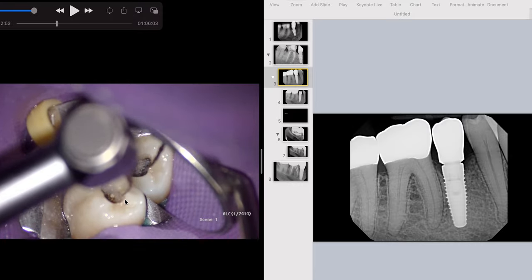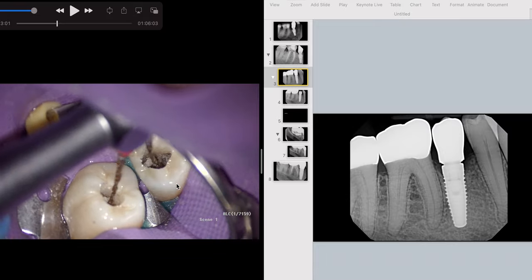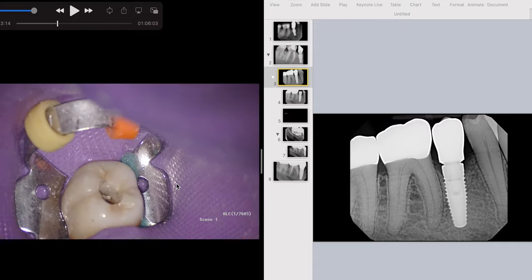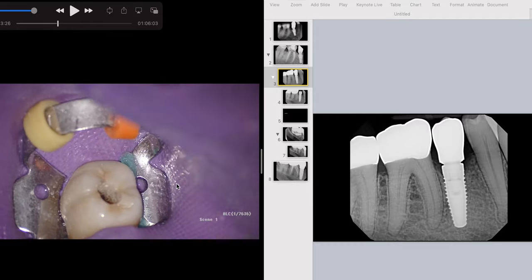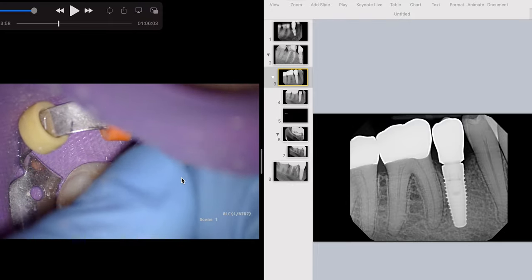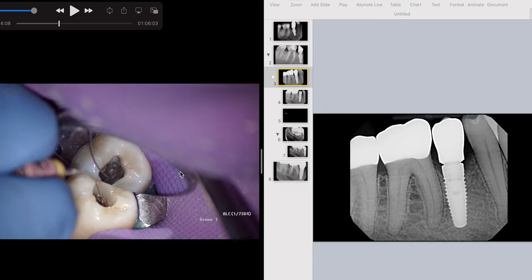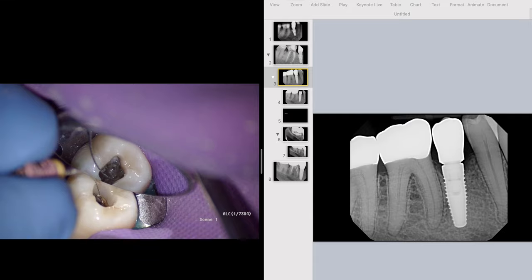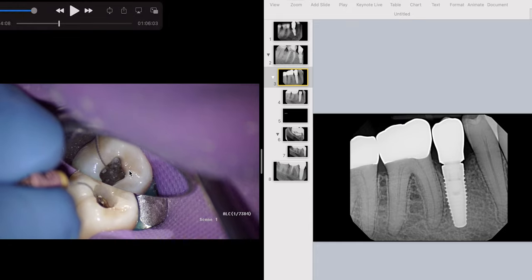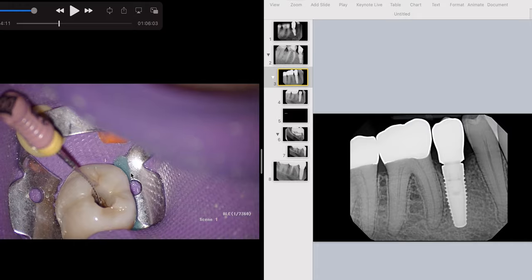Watch the curve on my file — I place a curve on it and set it right in that little orifice. This is not for the faint of heart. We work our way down and open up that orifice. Now it's time to get some hypochlorite down here — we're using full strength with a side-vented needle bent at 18 millimeters so I know exactly the depth. The key teaching is to open up the coronal two-thirds of the canal first, then place a file. Don't jam pulp tissue apically — get rid of it. Wave One Gold is beautiful for that.